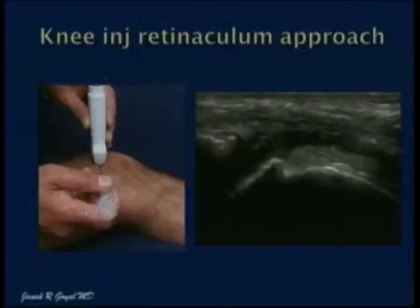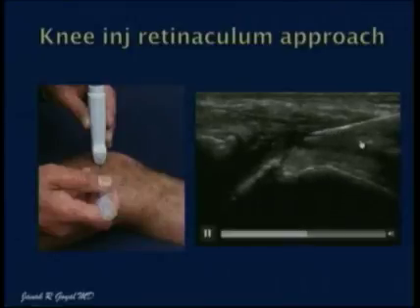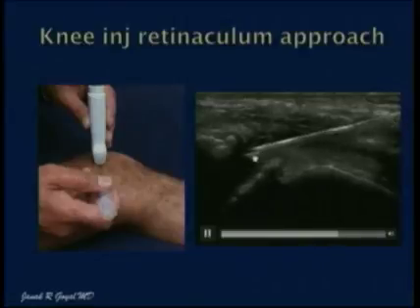Here is an approach from the retinaculum. It's basically the approach which we usually use for the blind injection, but I use my transducer to look at the position of my needle, and here is the needle getting into the knee joint for my proper injection.